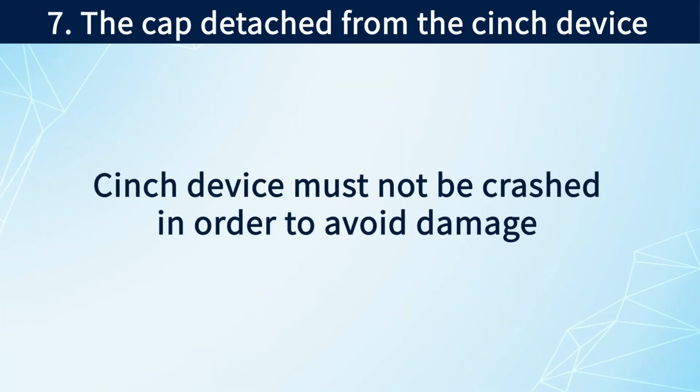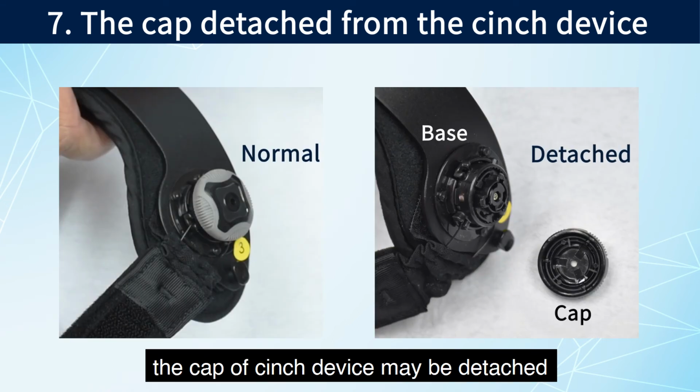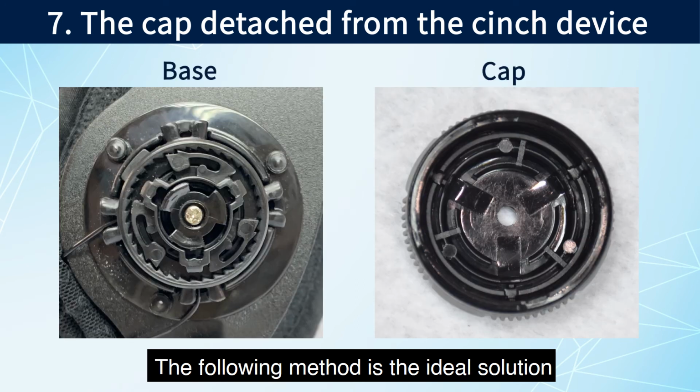7. The cap detached from the cinch device. Cinch device must not be crashed in order to avoid damage. If the brace was being crashed, the cap of cinch device may be detached. The following method is the ideal solution.